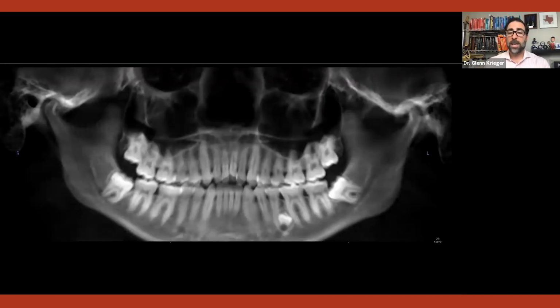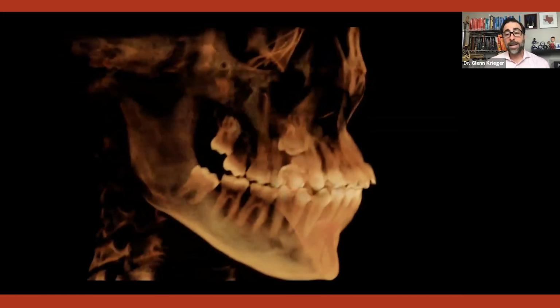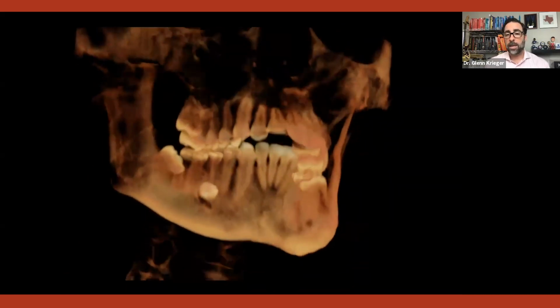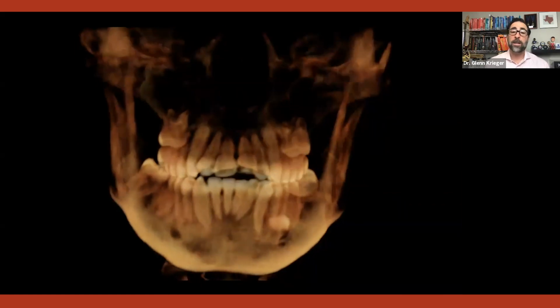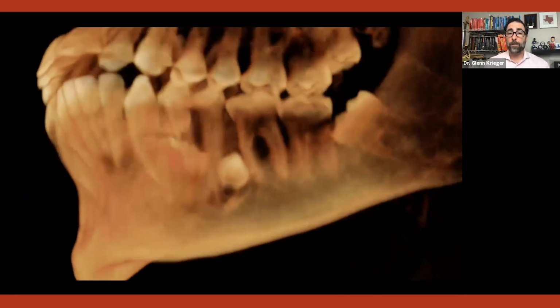here, right? Am I going to take out lower first bicuspids if the surgeon needs to go in and take out that tooth? And do I want to make a decision on whether they need to take out that tooth based on this x-ray? Or do I want them to really be able to see it in a CBCT kind of level, right? Again, if they've got to take that tooth out, I can't imagine them wanting to take out the 4 or the first bicuspid and dig around for that tooth around the apex of the second bicuspid. So I'm not saying I would take out second bicuspid if that tooth were taken out, but maybe I would. Maybe the surgeon would prefer it. I don't know. It's going to play a role.